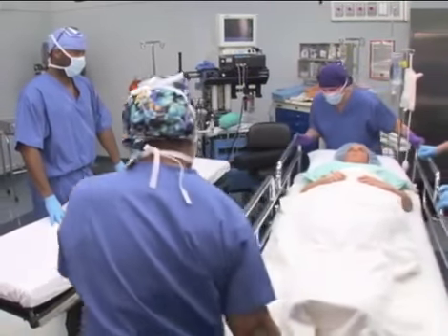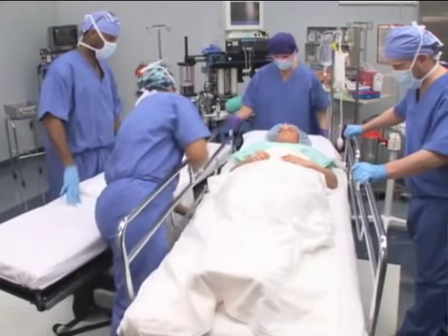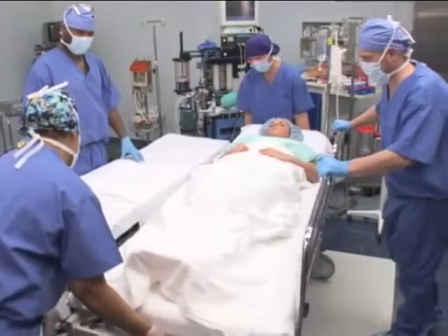To transfer a patient from a stretcher to an operating table while the patient is conscious, at least 4 people are required and careful technique must be observed to avoid injury. Align the stretcher with the operating table and make sure the wheels are locked on both the stretcher and the table. Never move a patient onto an operating table with wheels that do not lock. The patient may fall to the floor between the stretcher and the table.